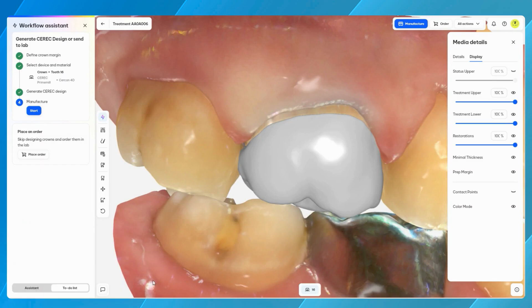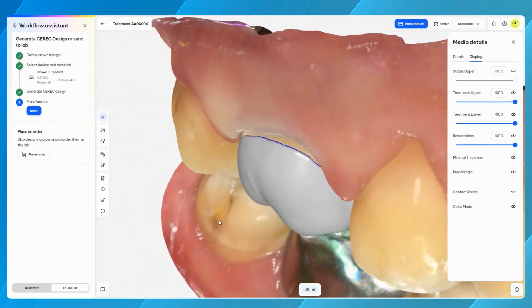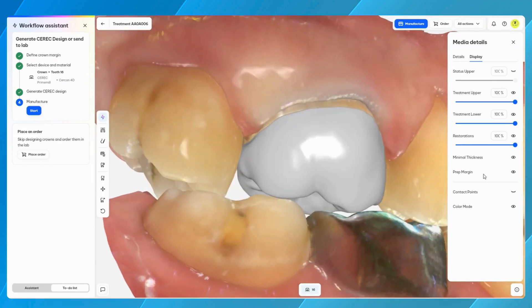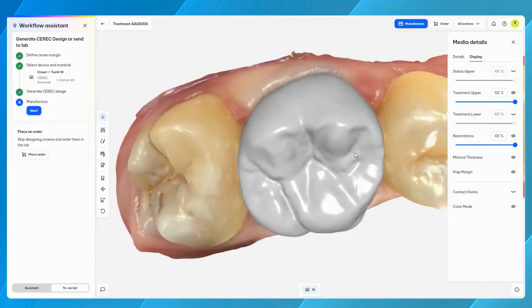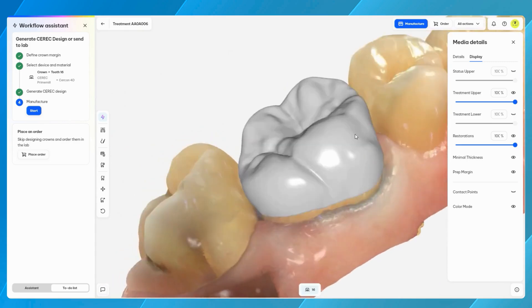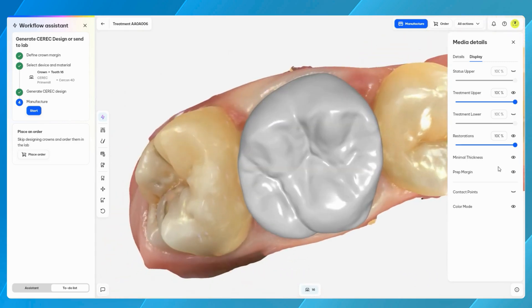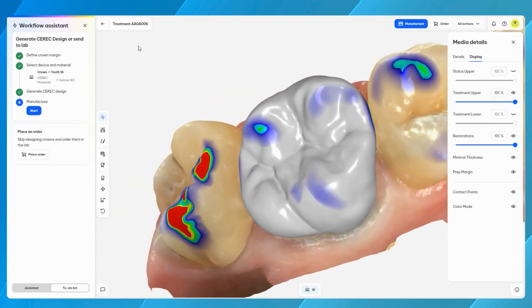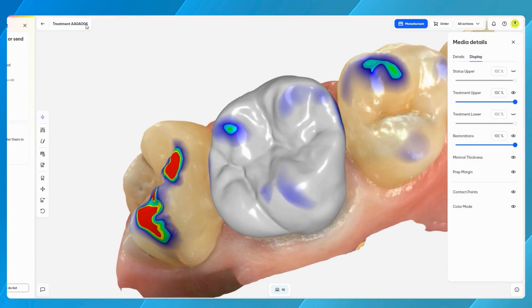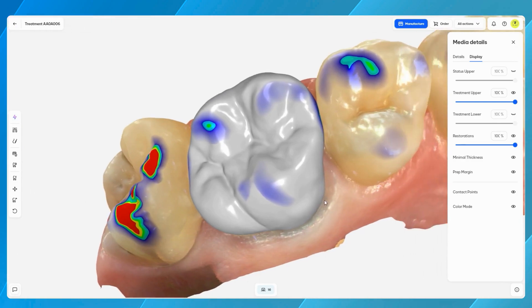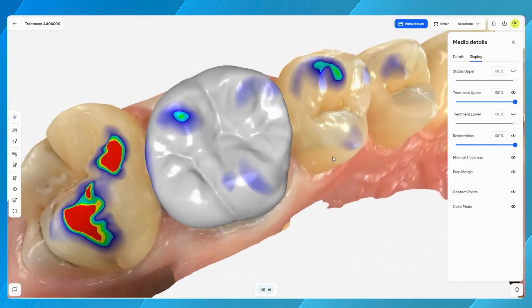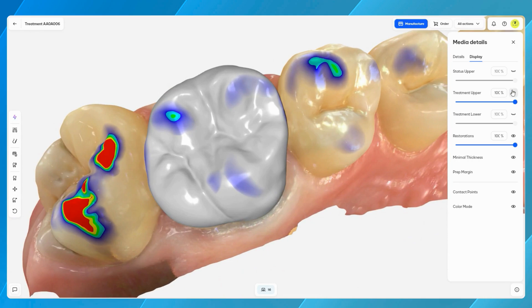To maximize the space on the screen, close the workflow assistant. Open media display options to further refine the view. This control panel allows adjustment of the translucencies of the scans and restoration, with options to hide the scan, restoration, and allows for an isolated view of the restoration.